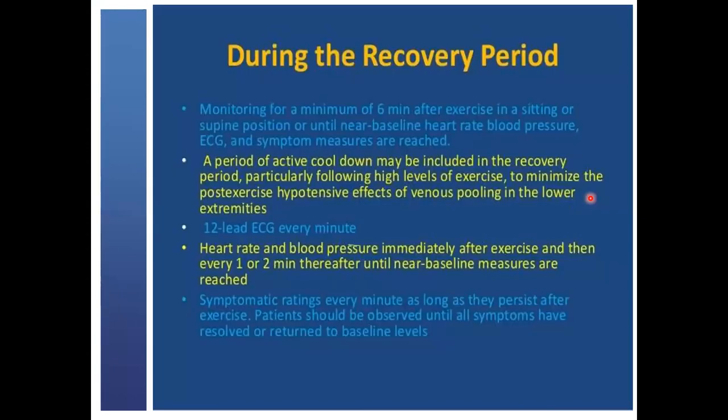So after the test has been concluded, you have gotten to the point where you need to stop. The next phase, at the end of peak exercise, heralds the recovery period, which we mentioned. During this recovery period, you have to monitor for a minimum of 6 minutes after exercise in a sitting or supine position until near baseline heart rate and blood pressure, and the ECG and the symptoms must also have gotten back to baseline. Sometimes you might need a period of active cool down included in the recovery period, particularly when you have achieved very high levels of exercise. This is usually done to minimize post-exercise hypotensive effects of venous pooling in the lower extremities.